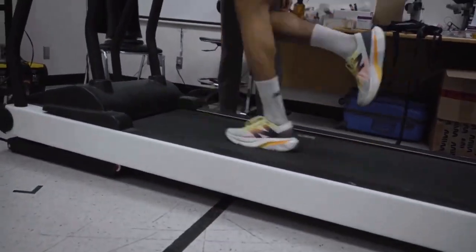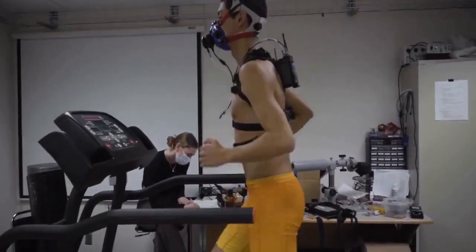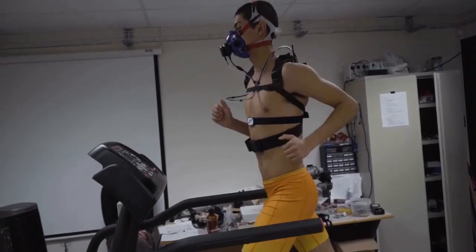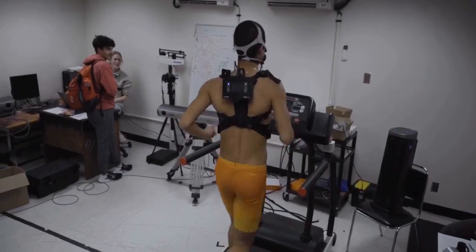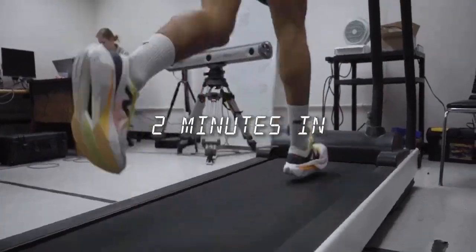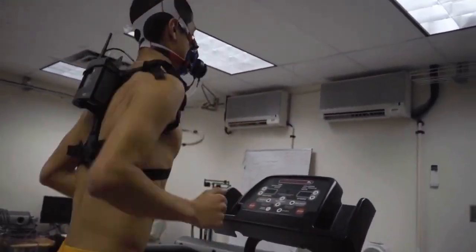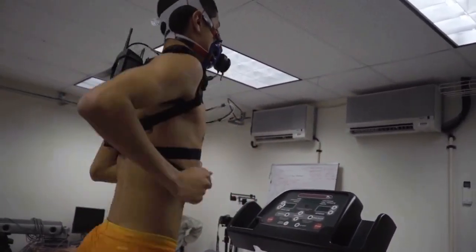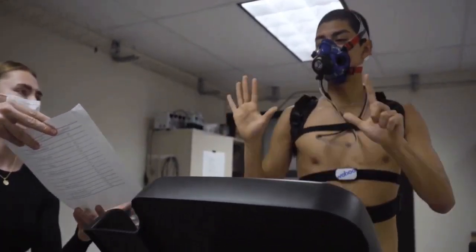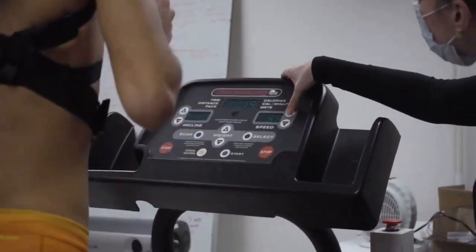Okay, we're starting the test in three, two, one — and we're on. Three, two, one, going up.